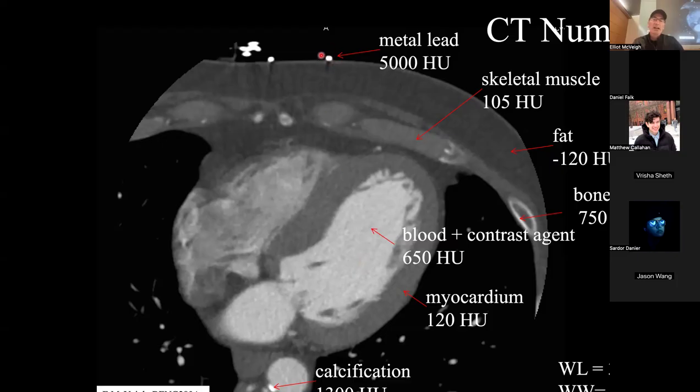This is a wire, and it's an ECG lead, just to measure the person's ECG. And the Hounsfield unit there is 5,000, right? So that mu value was really high compared to water, 5 times greater.